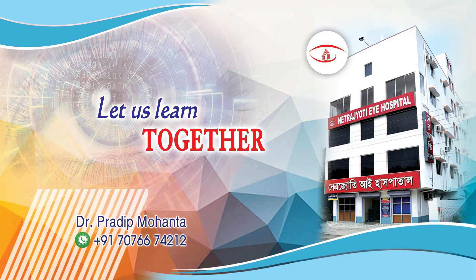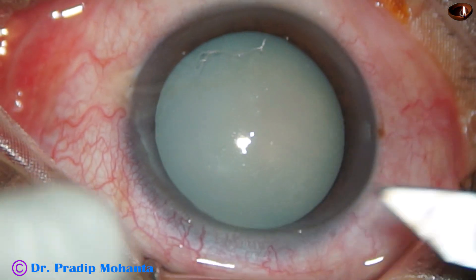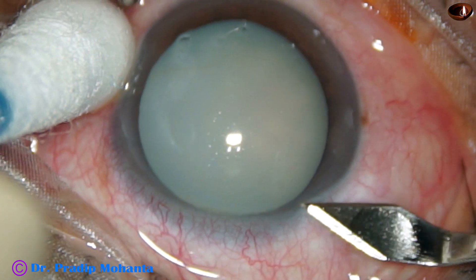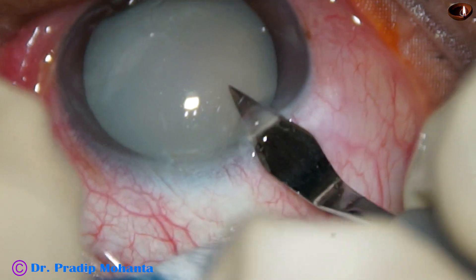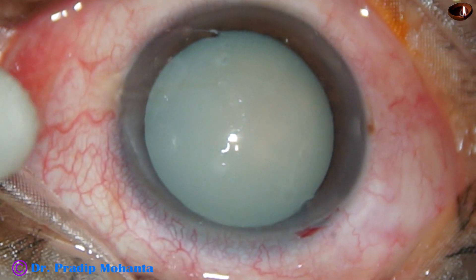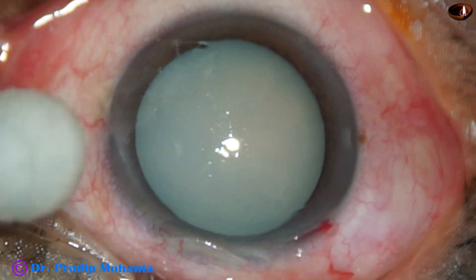Friends, welcome to my workplace at Ranaghat, West Bengal, India. This is a hypermature Morgagnian cataract. The patient came with normal intraocular pressure. Usually such cases come with phacolytic glaucoma, but this case came a little early. Intraocular pressure is normal, the normal eye is quiet, but we can see a homogeneous appearance of the lens mass.